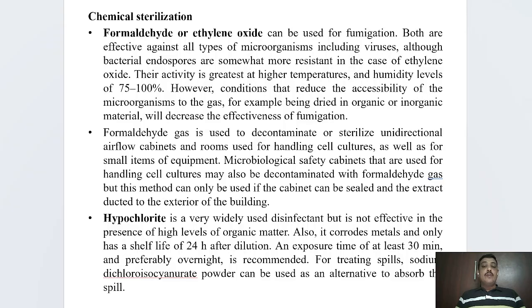And apart from that, we also use hypochlorite. It's also widely used as a disinfectant. So again, it's a chemical. If you are going to use it as a disinfectant, we have to use it on the surfaces where we are going to work. A disadvantage is that it is not effective if there is organic matter present.